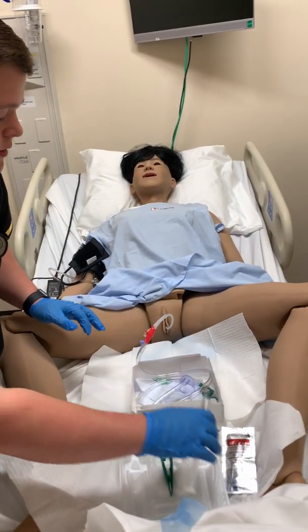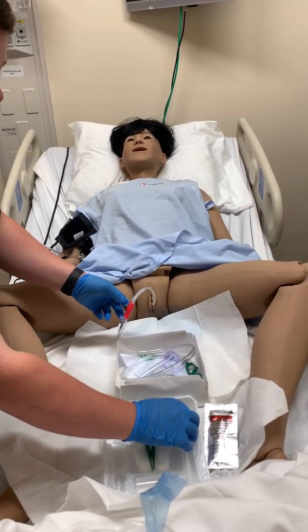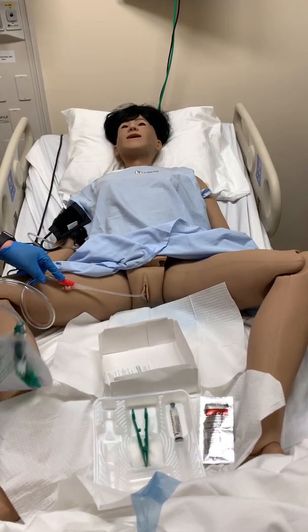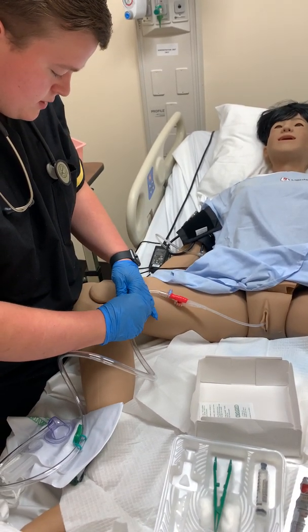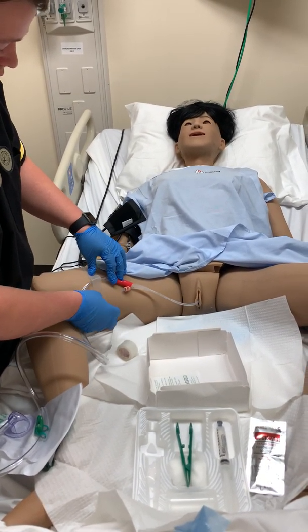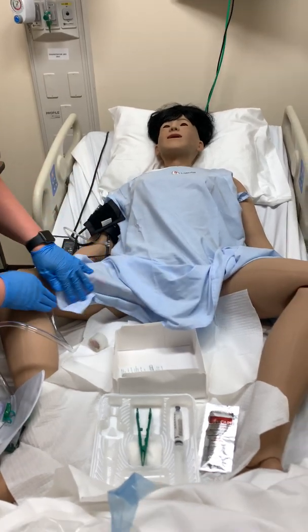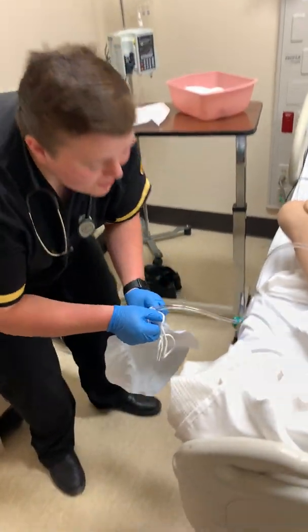All right, so there we are. And we can go ahead and inflate the balloon. So at that point, we're going to take the bag. We will go ahead and tape the catheter to Ms. Smith's thigh. All right, and that is stuck down. And we will go ahead and attach the bag to the bed, not the bed rail, but the bed frame, which is down here for us.